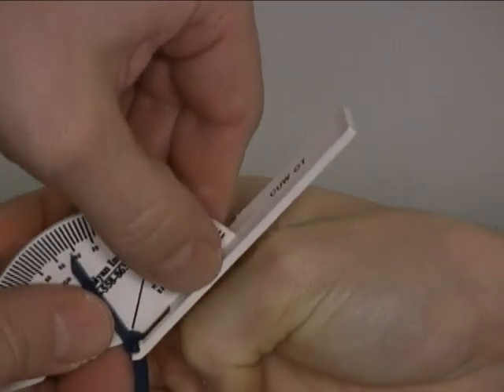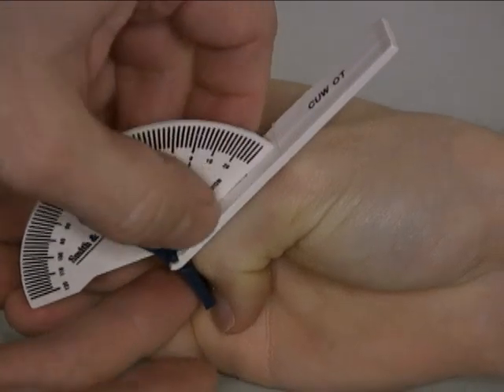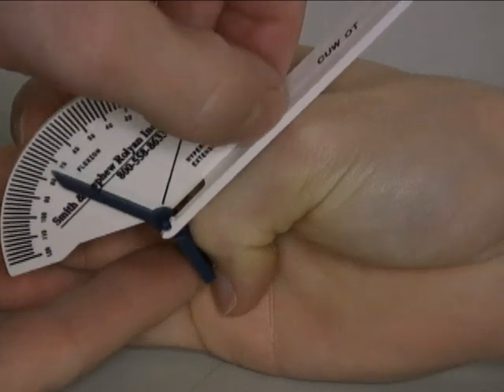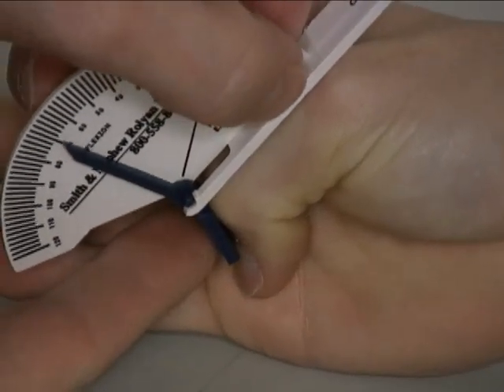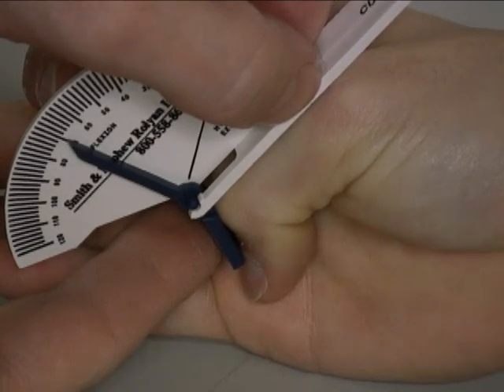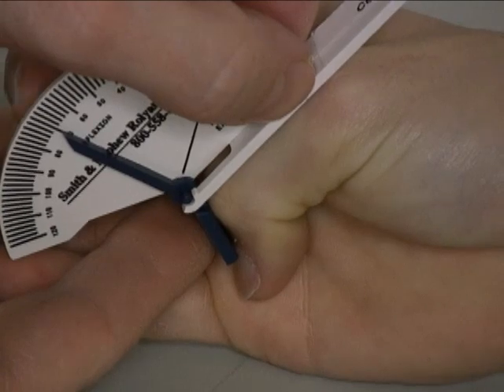The ASHT method, however, uses a goniometer with a shorter moving arm that ends at the base of the thumb nail. So that does not extend all the way to the end of the nail. And that gives us a different measurement, almost 70 degrees of thumb intraphalangeal joint flexion.